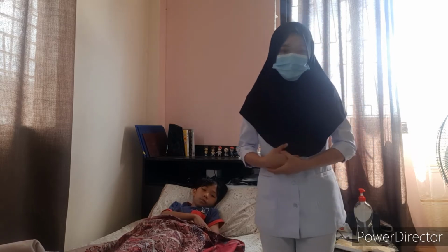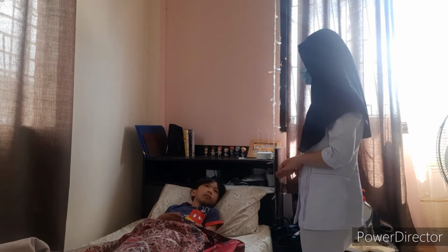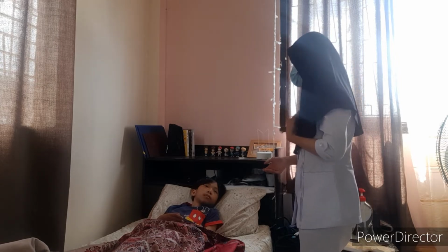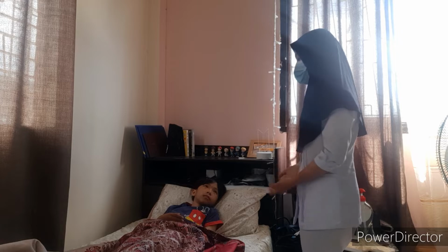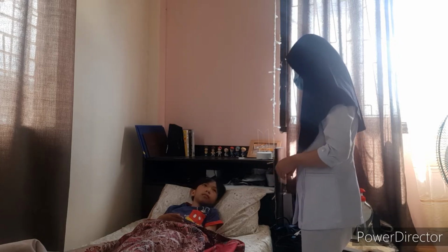Good morning, sir. I'm Hayan Betara. I'm your attending nurse for today. So, sir, I am going to assess your body temperature so that we can know if there are abnormalities in your temperature. Is it okay, sir?